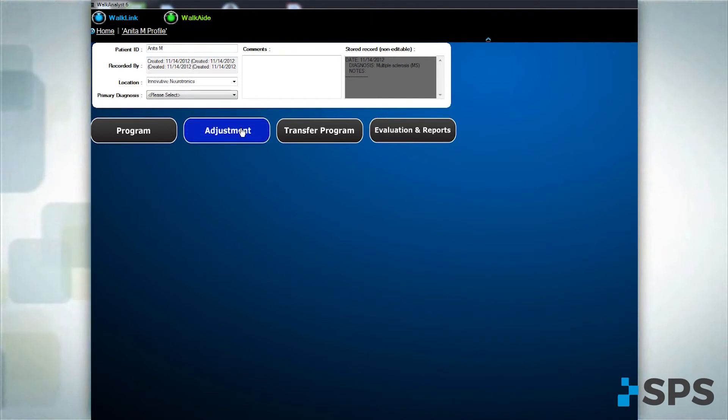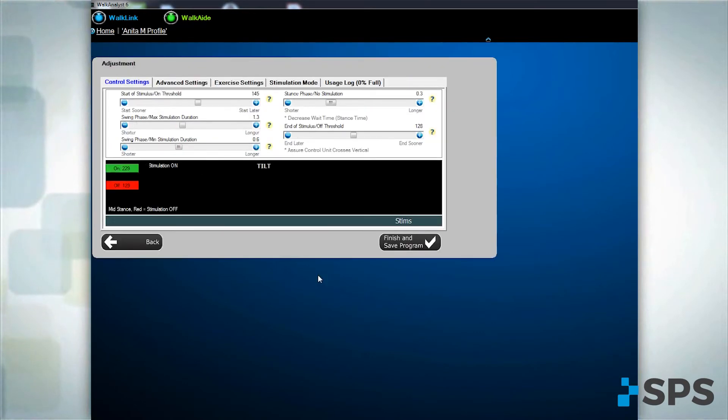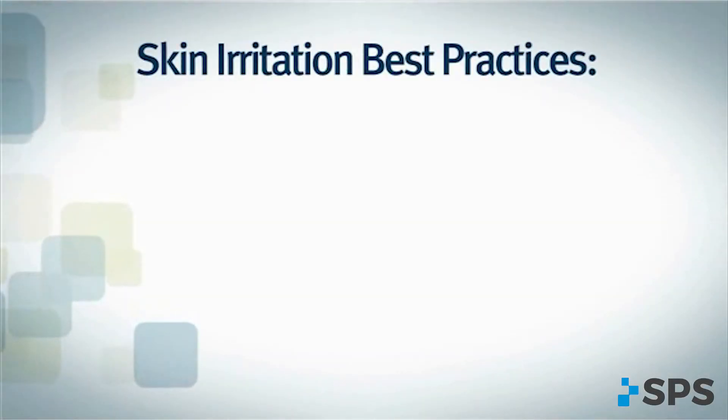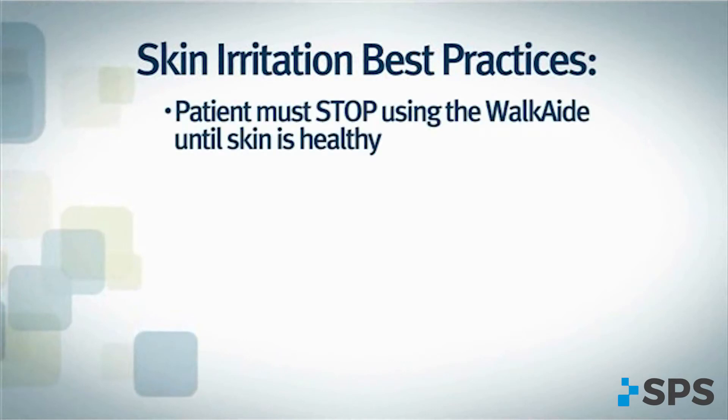After opening the patient profile, select Adjustment and adjust control settings. If the patient complains of skin irritation or you notice signs of it, instruct the patient to discontinue use of the WalkAid.